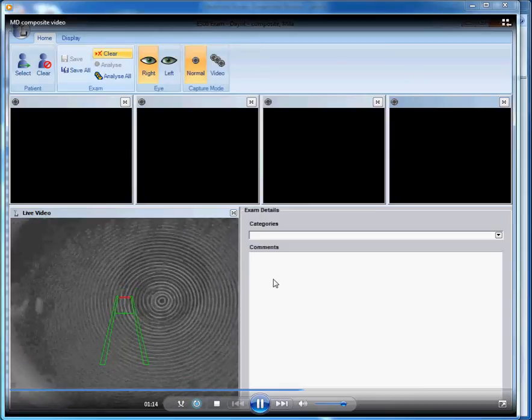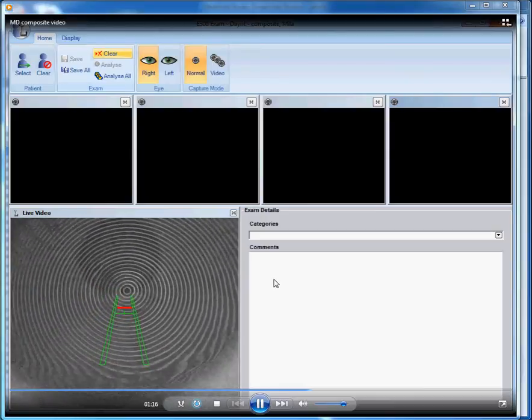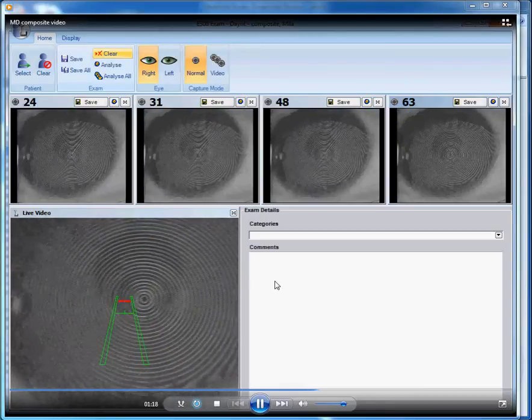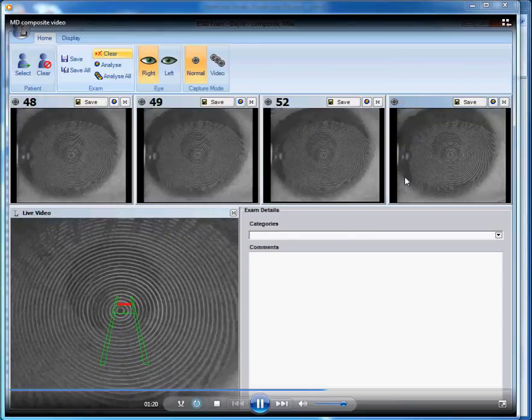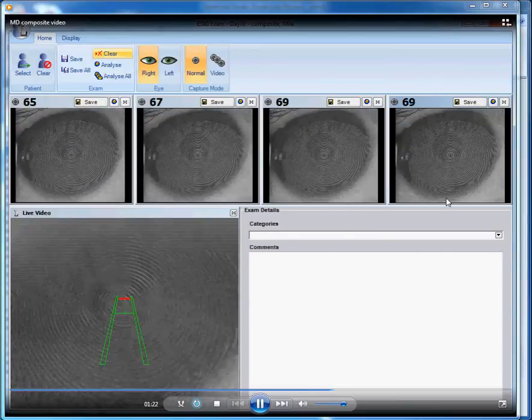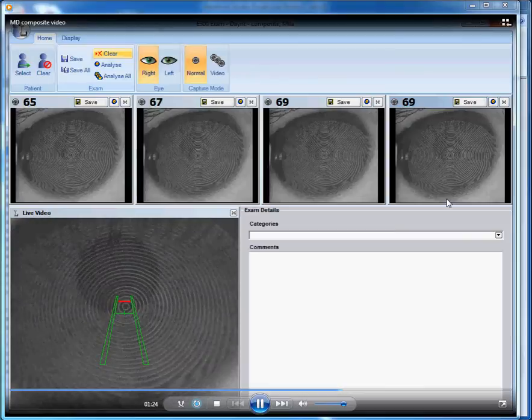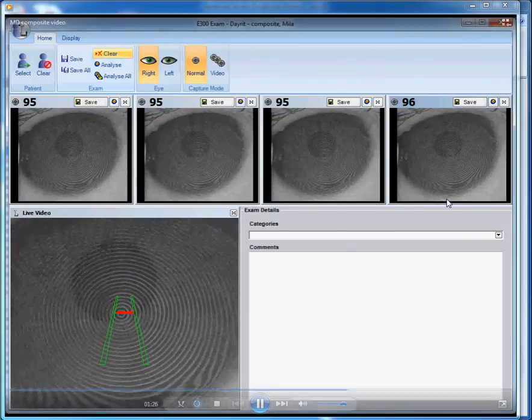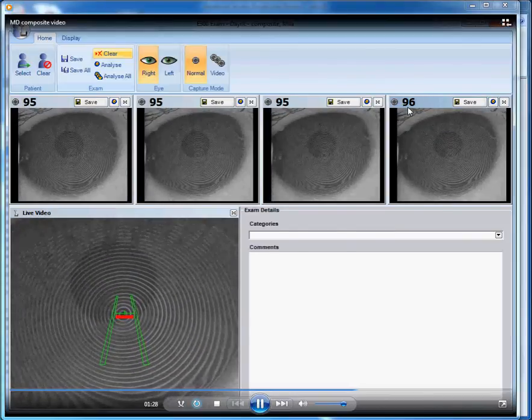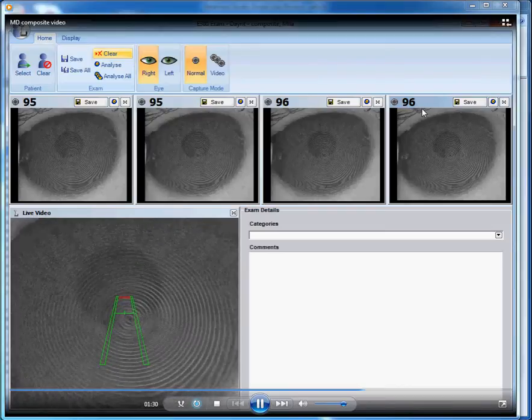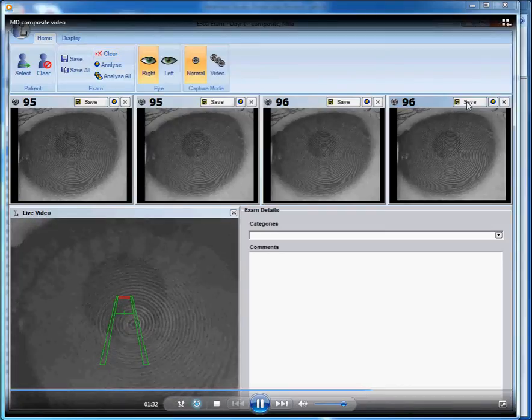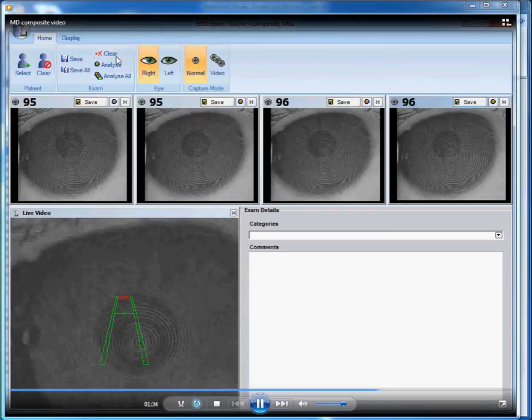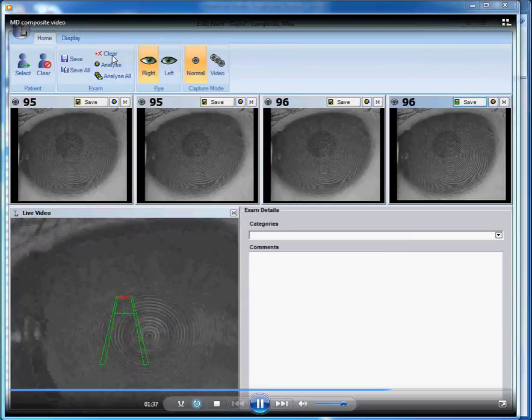Now we're on our fourth image. We're going to have the patient look superior three to five rings, and push that placido reflection to the inferior cornea and sclera. Once we have a 95% or better image, then we'll click Save Images, and Clear, and take our last image.